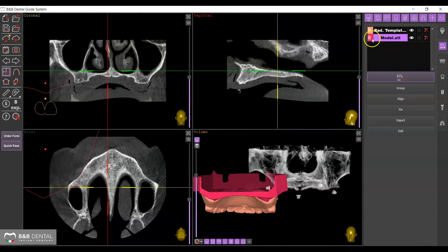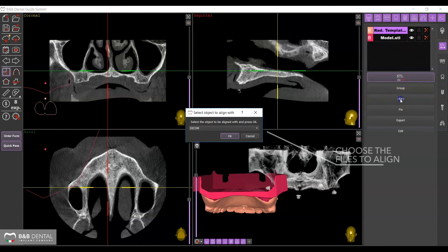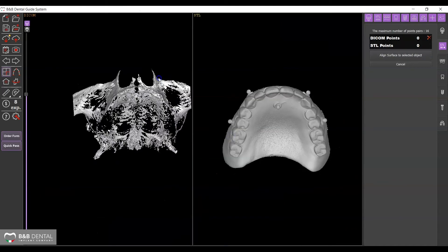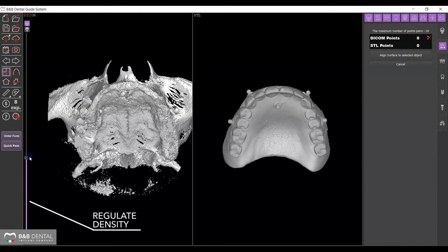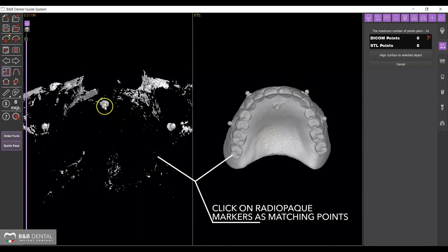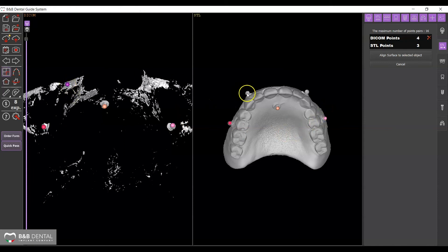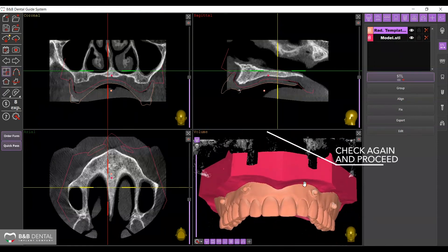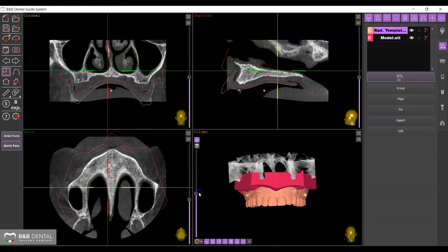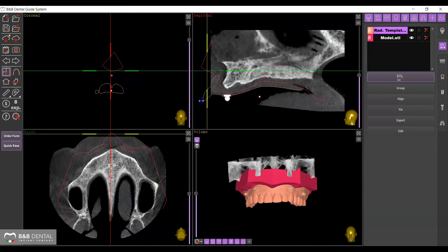This action allows you to move them in space easily and place them simultaneously on the DICOM using the Align function. A window will appear where you can indicate which files you want to match with the two STL files — select DICOM and proceed. The screen will be divided in two parts with the DICOM file on one side and the STL model on the other. Proceed to select the markers: the selection must be performed on one file first and then on the other by selecting the point in the same position. Use the Align Surface to Selected Object button to finalize the matching. You can check the position of the matching on the home screen by using the cursors to verify that the STL file corresponds to the profile of the DICOM.